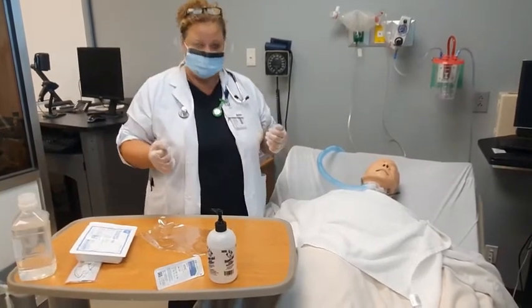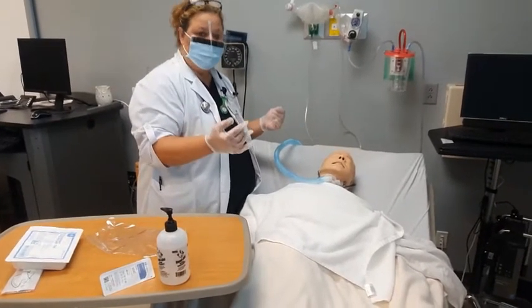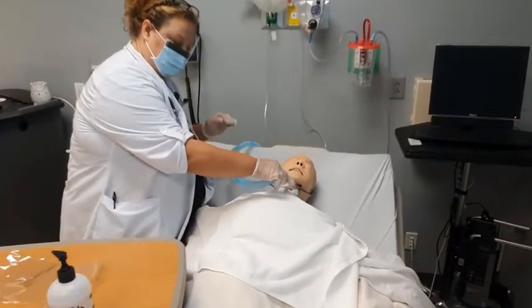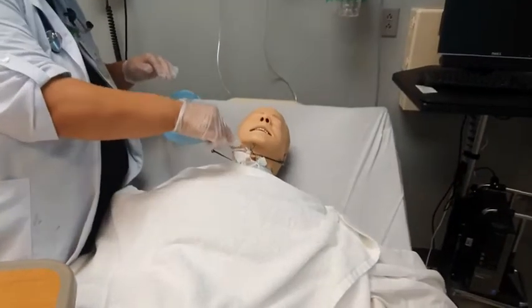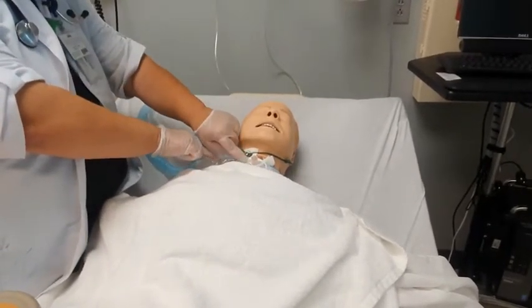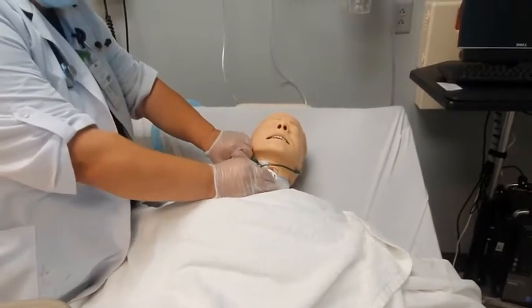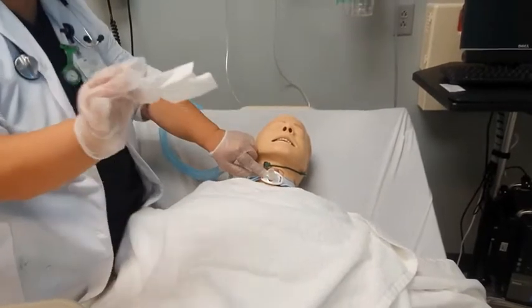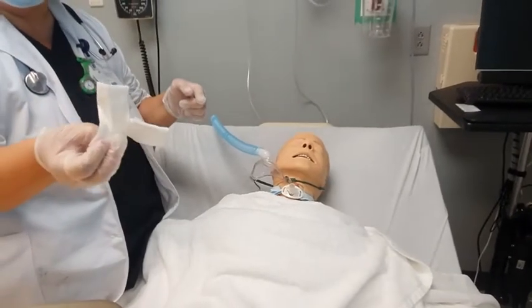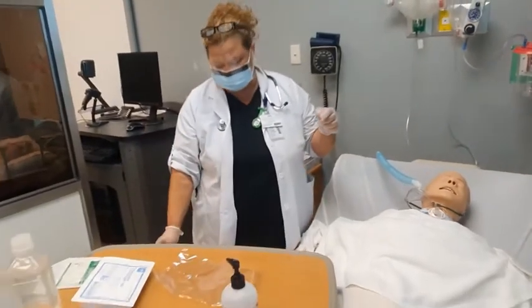Gently hold the trach tube with one hand as you carefully remove the soiled gauze and discard it with the other hand. As you know, this person does have a trach collar on. You would move this gently to the side of the patient. You'll take your hand, this is not a sterile part, and then you would take this gauze that's in here and slide it out. That's when you're looking to see the color, the consistency, if it has an odor to it or anything. Then you dispose of it in the garbage can that you've already got set here to the side.